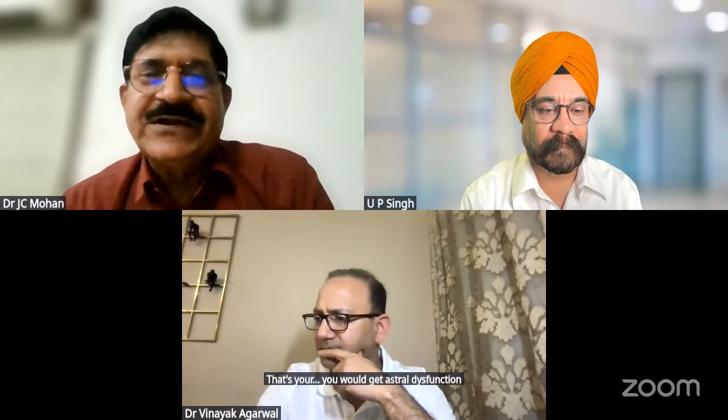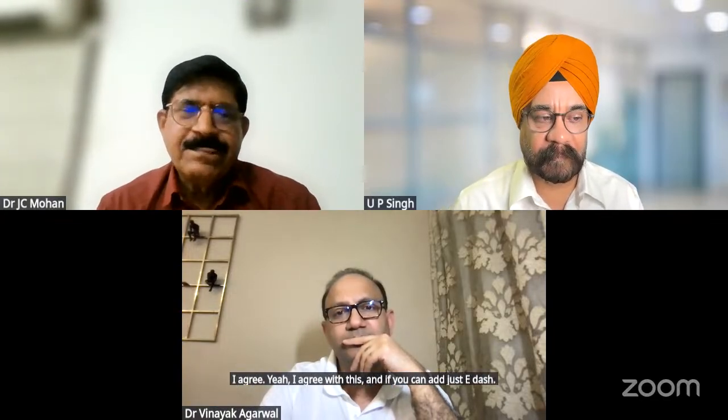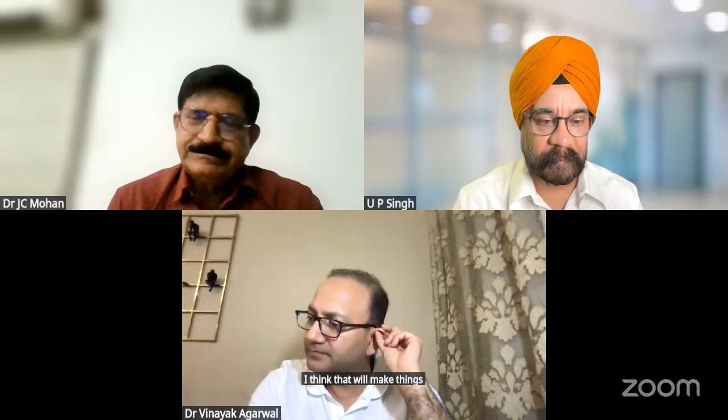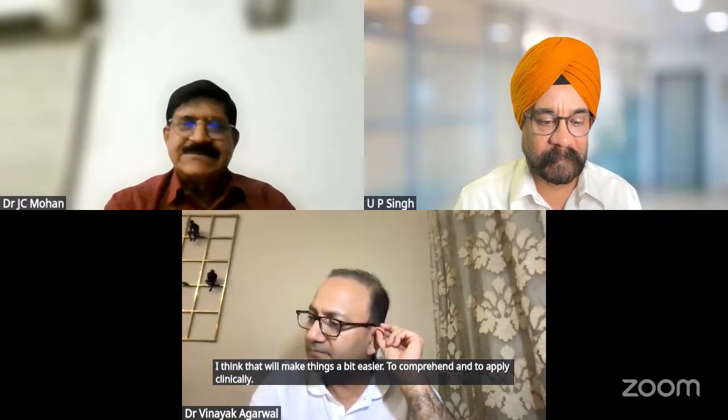I agree. You would get diastolic dysfunction, and you'll get elevated filling pressure. I agree with this. And if you can add just E dash and E over E prime, along with LARS, that is left atrial reservoir strain, just these three parameters, I think that will make things a bit easier to comprehend and to apply clinically. Yes, I am in agreement with you.